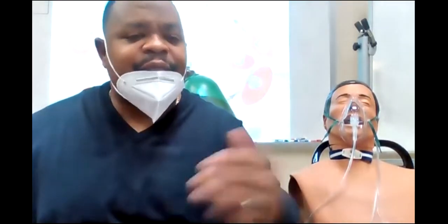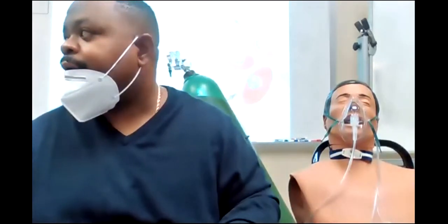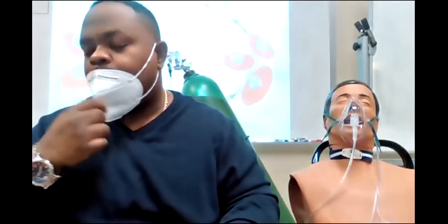Now, so he's on oxygen, but when it's time to eat, he can't eat. So now, what do you recommend if he's on this and it's time to eat? What should I switch him to? The nasal cannula. I would do a nasal cannula if he can tolerate just a nasal cannula, depending on how much he's on, right? All right, so let's continue to look at the simple O2 mask.